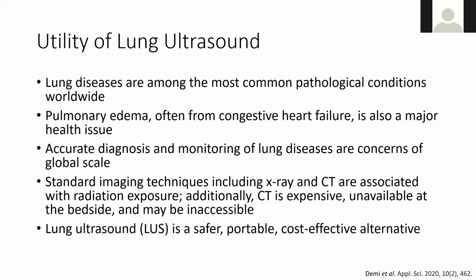Standard imaging techniques which we use, including X-ray and CT, are obviously associated with radiation exposure. And additionally, CT can be expensive. It may be unavailable or inaccessible at the site that you're working at, and it's also unavailable at the bedside. So lung ultrasound makes for a safer, portable, cost-effective alternative.